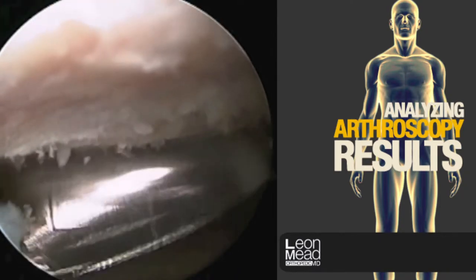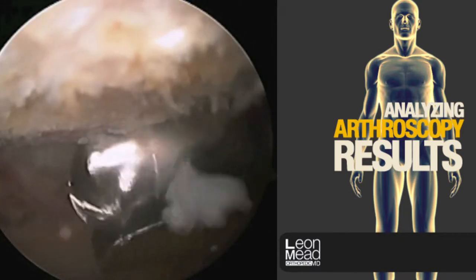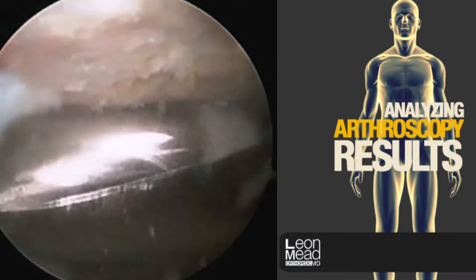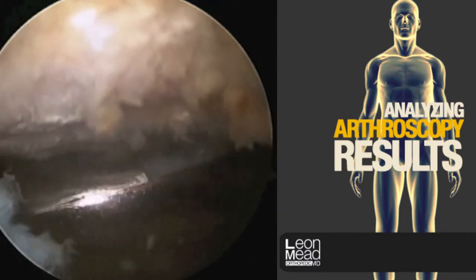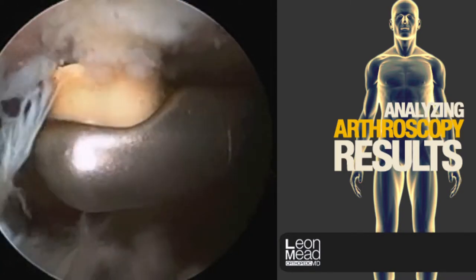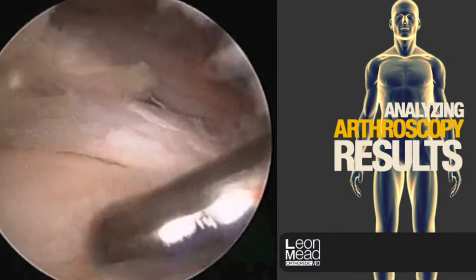We've now changed our viewing and working sides — looking from the back, working from the side. We want the undersurface of the acromion bone to be smooth and flat in two planes. As we continue to work here, we're slowly removing bone. We don't want to remove too much bone. Here you can see the finished product of the acromioplasty — nice and smooth and flat.